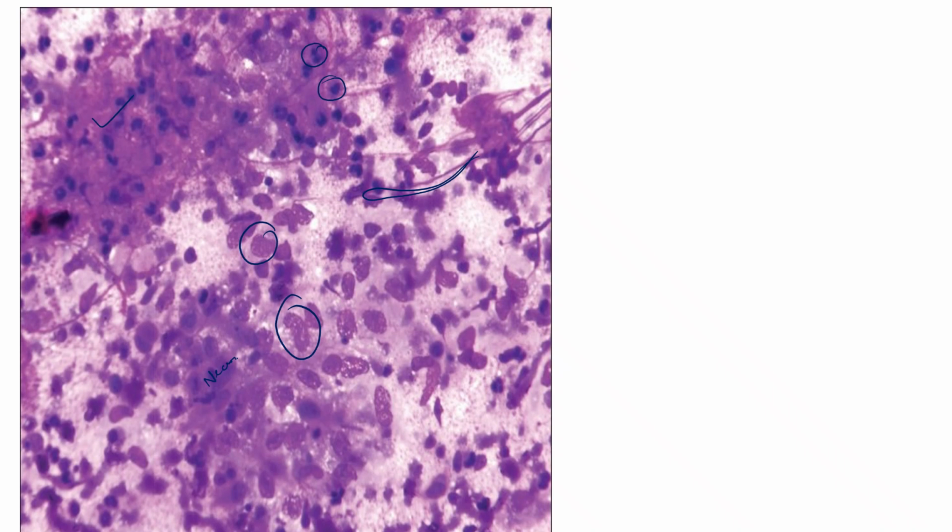No, not in this case, because you are getting necrosis, epithelioid histiocytes, and there will be lymphocytes and plasma cells. Yes, I see this plasma cell here. But this is a case of cold abscess.